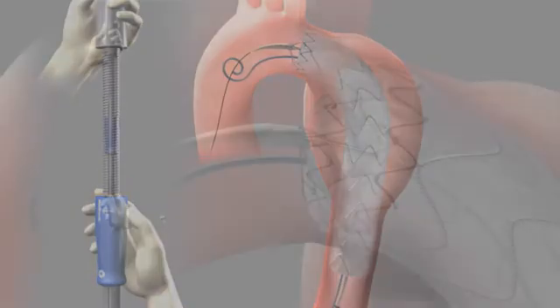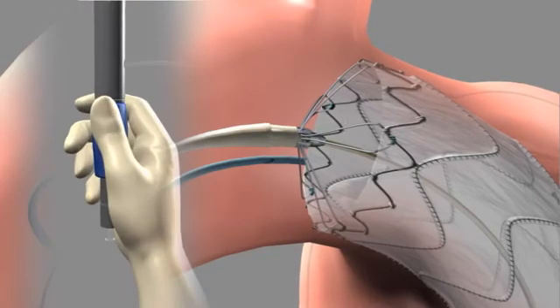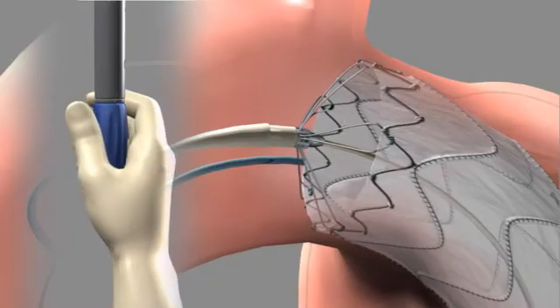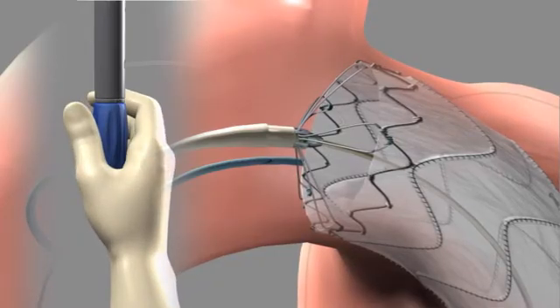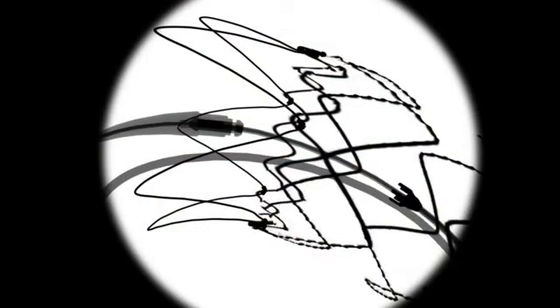To deploy the tip capture mechanism, hold the front grip steady with one hand. With the other hand, rotate the tip capture release handle counterclockwise to unlock, then pull it back to deploy. Observe the opening of the proximal bare spring under fluoroscopy and confirm that it has been completely deployed.